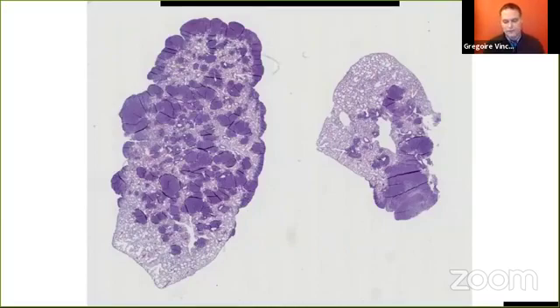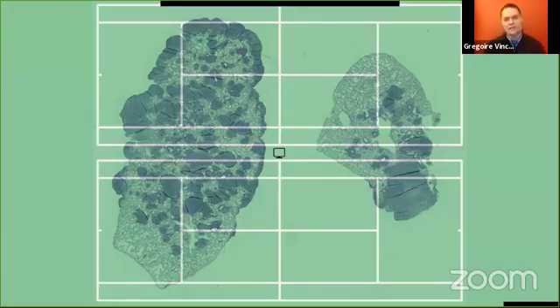If you look at your fingers and you look at your nails, it's quite the same size, so 15 by 15 millimeter. But when you scan it with a scanner which has the same resolution of a microscope, which is actually 200 nanometers for 1 pixel, it will give you a very huge image. And if I open this image on the classical resolution of my screen, it's like if I have to explore 2 tennis courts with my screen. So the game here is not only the complexity of the image, but also its size.